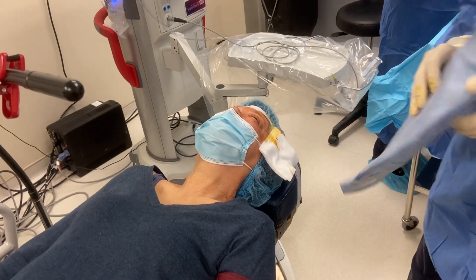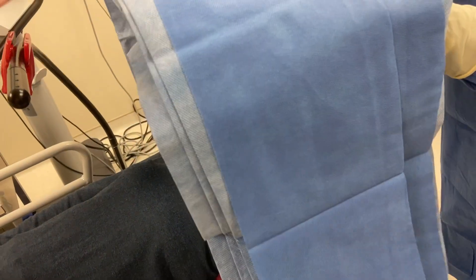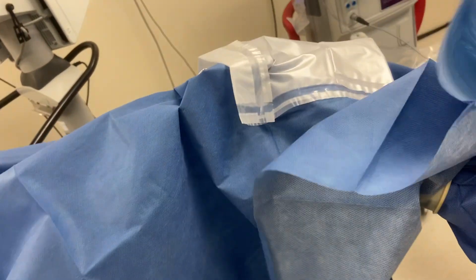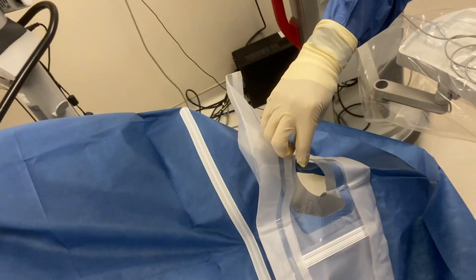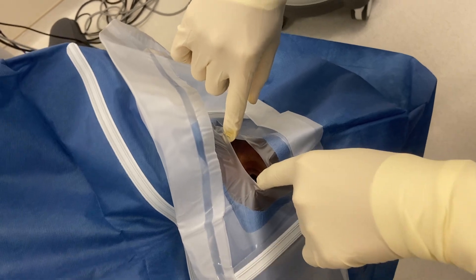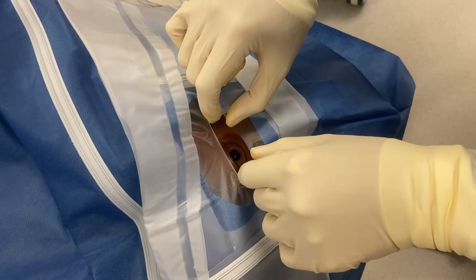Okay, open your eyes. The key with this is that you have to put tension on both sides. By having your fingers like this, you can put tension on the upper and the lower. This is a no-touch technique for eye draping.